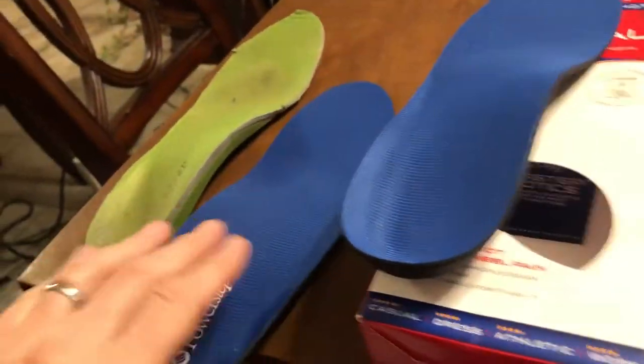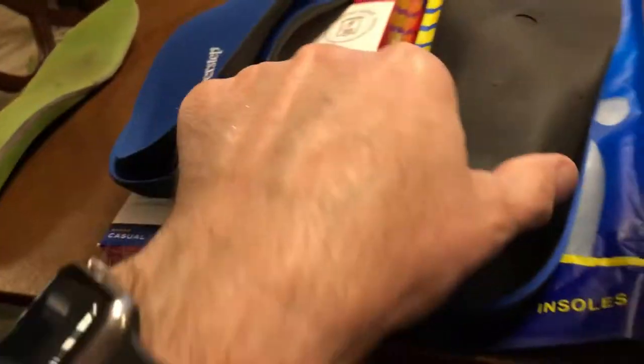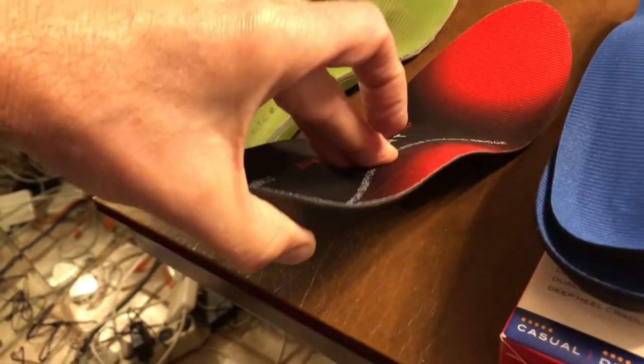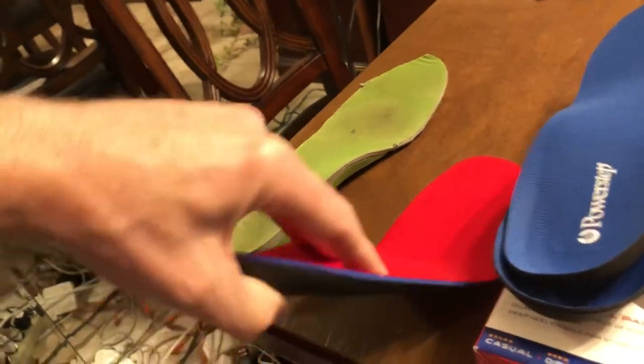My next test is checking that each insert provides stiffness in the center to support against plantar fasciitis. The Power Steps are nice — push on them and they're definitely stiff in the center. Walk Heroes are the same: one nice stiff piece that flexes only at the toe. Physics Gear soles are also stiff in the middle, and they're really thin, which I like.